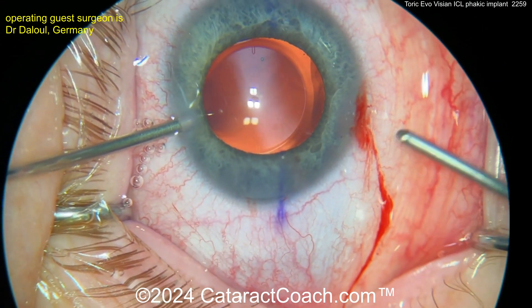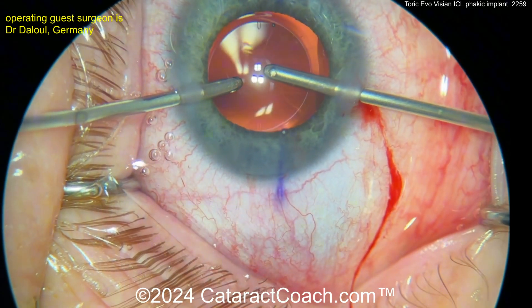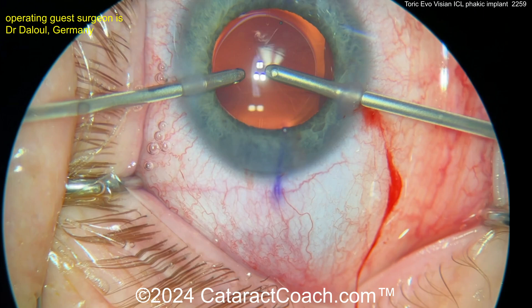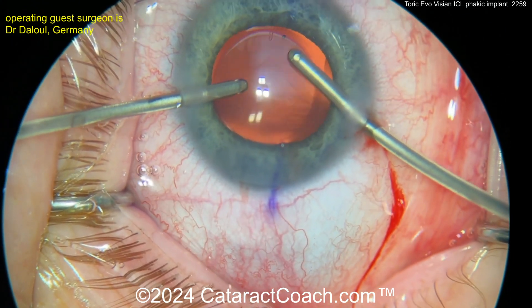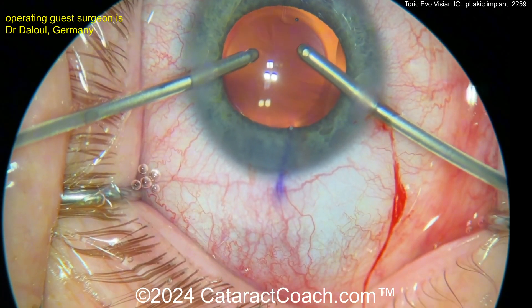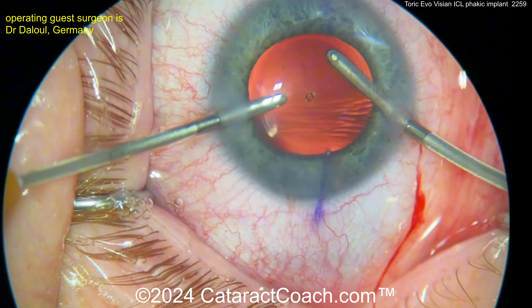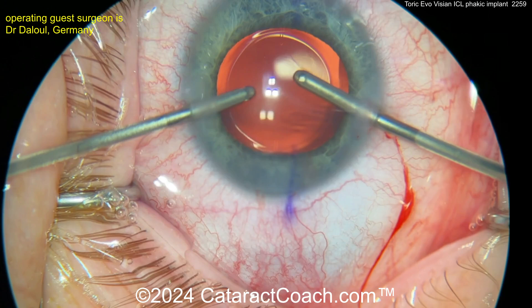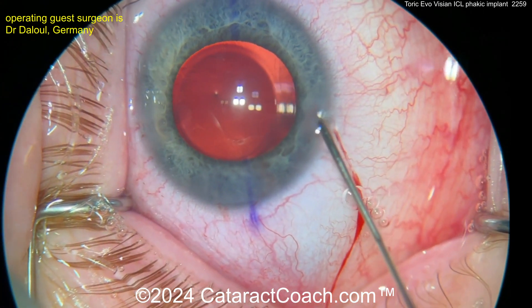At the end, the pupil came down a little bit — probably put in some miotic agent. Now a little bimanual IA. Get the infusion higher than you think it needs to be — you don't want the anterior chamber to flatten out at all. This is the newest EVO version, which has a central opening in the optic, so you do not need to make a peripheral iridotomy, and you still have great flow of aqueous. The incidence of cataract is much, much lower with this latest version.